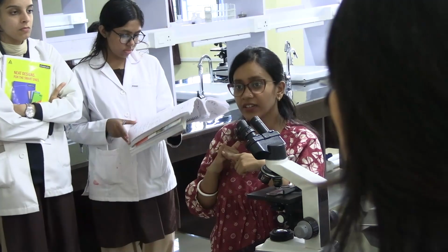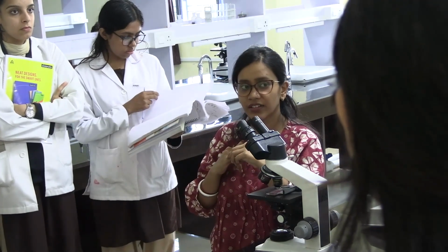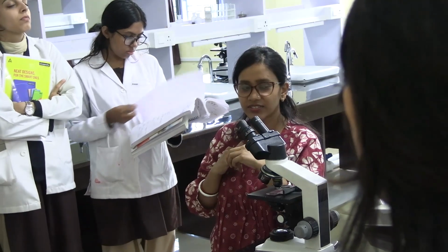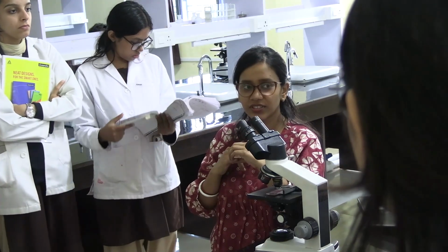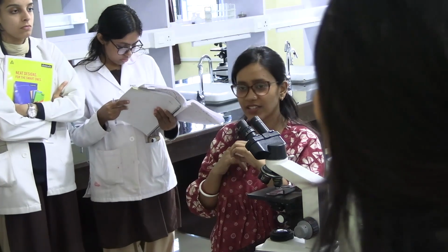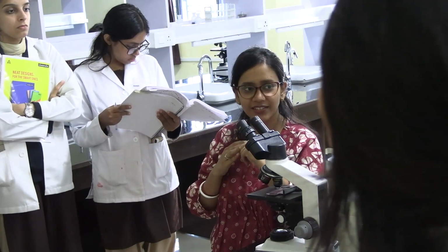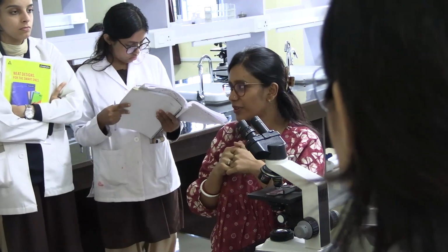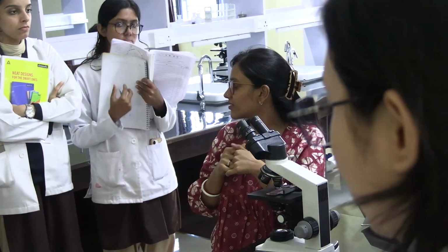Pink. Nucleus is pink. Darkly stained. Just throwing darts in the dark, no? Wishing something should hit the point. Someone will tell pink, the other one will say, I will say no, then the other one is going to say something else. It's not even been one day that this class has been taken.